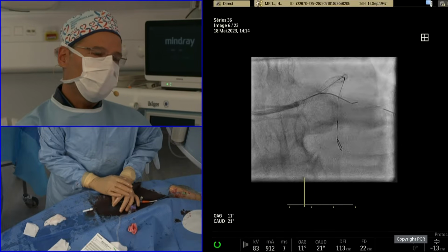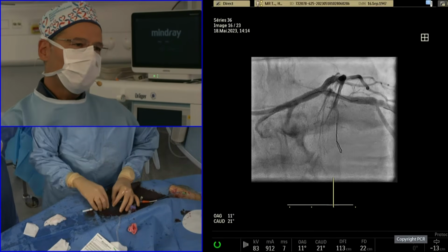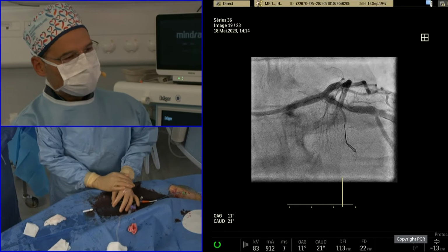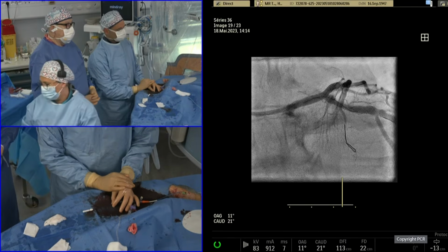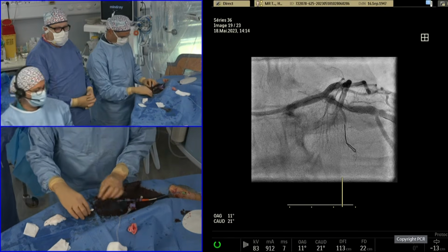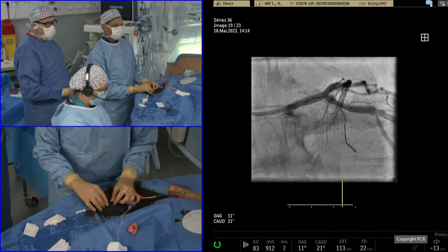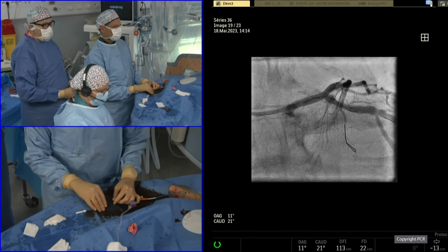So I think the positioning of the new wire is okay. And if you agree, I can remove the jade wire. Thierry and Bernard, I know it's not your standard practice to image at this point, but mindful of the fact we have the expertise of Yoshi and at least another 20 minutes of broadcast, would you consider an OFDI run now to assess that cross in terms of distal cross into the cell of the Nagomi?